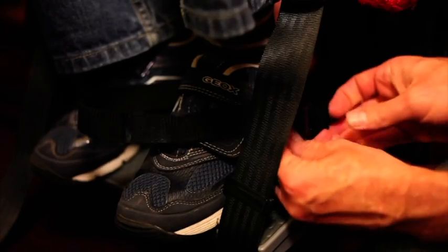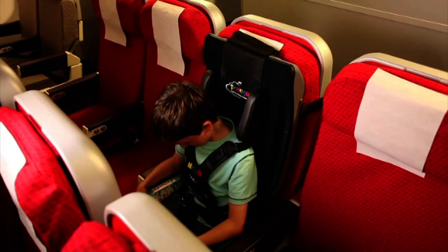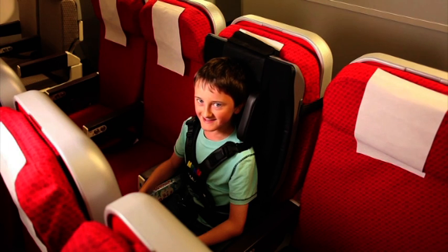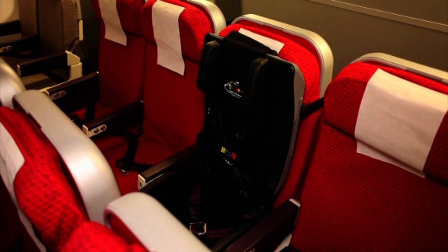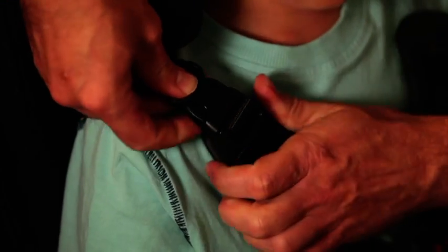The ankle huggers are an optional feature and provide additional foot support. Julian is now comfortable, secure and ready for take-off. Julian and other children like him may not want to be in the Travel Chair for the whole flight, but the Travel Chair must remain attached to the aircraft seat at all times, so that the child can be easily secured in the event of unexpected turbulence.